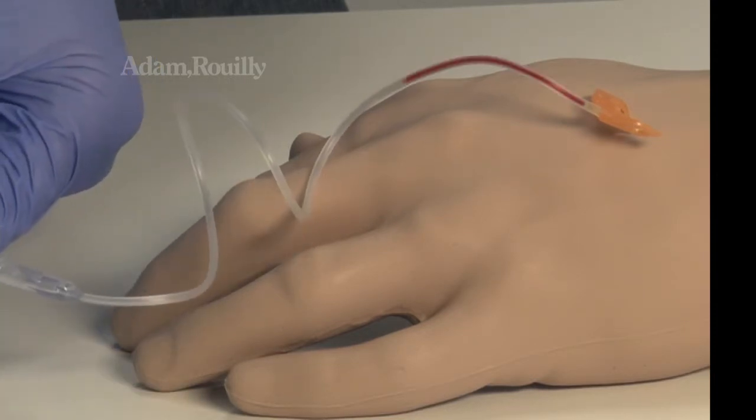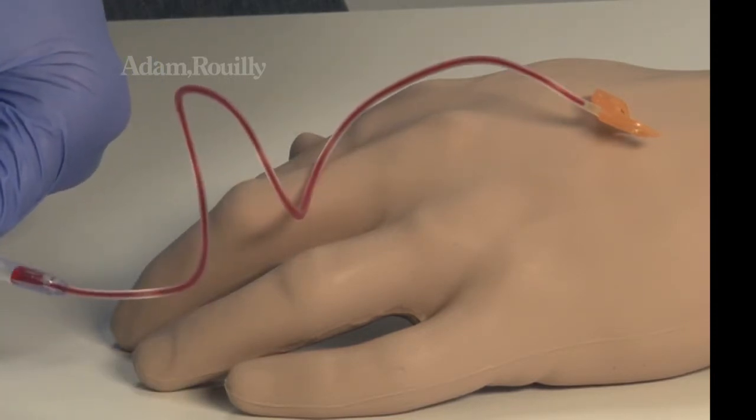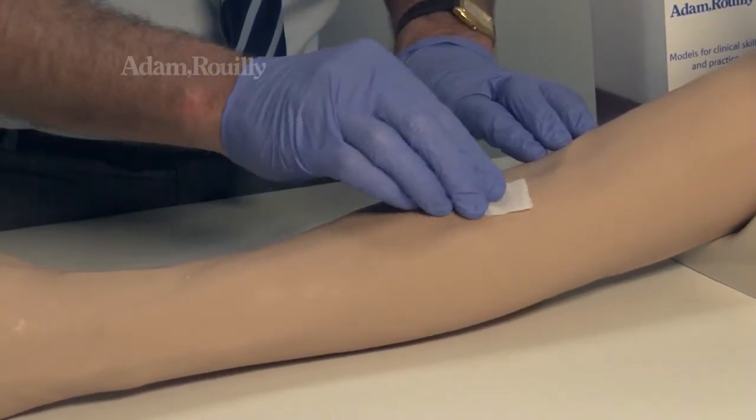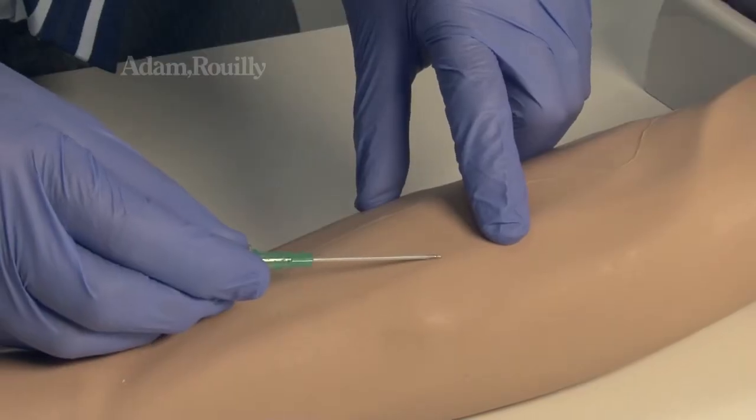Butterfly cannulas, cannulas, application of adhesive dressings and the set up and monitoring of infusions may also be used with the arm.